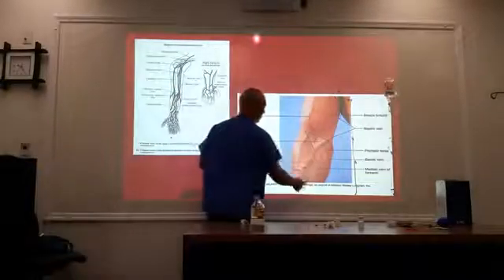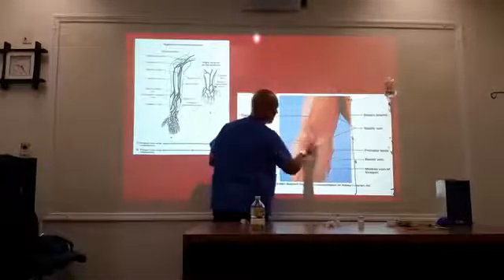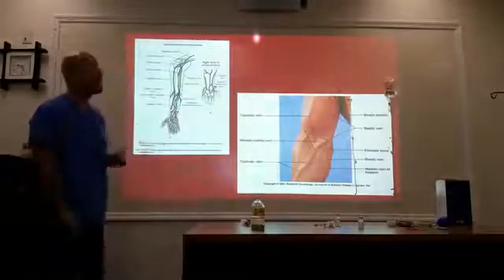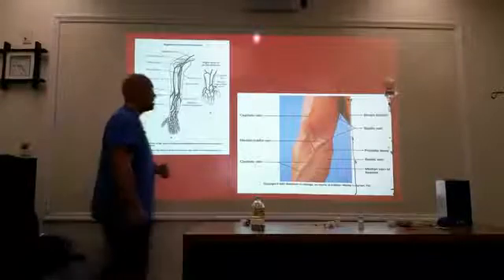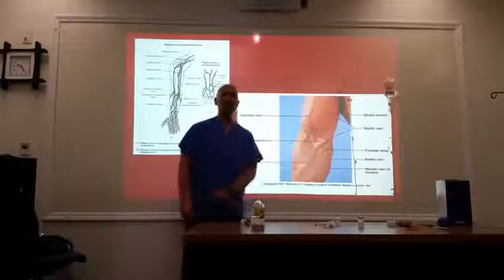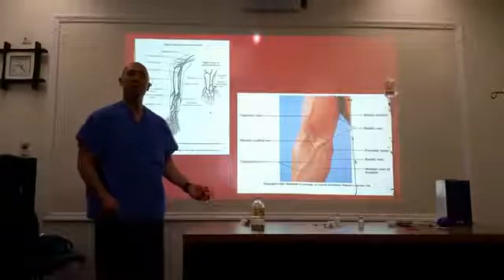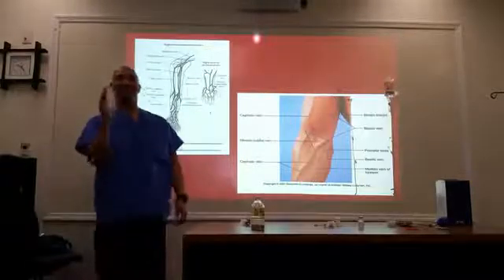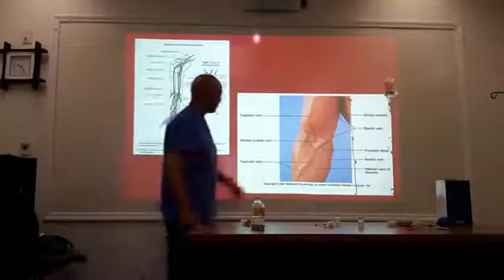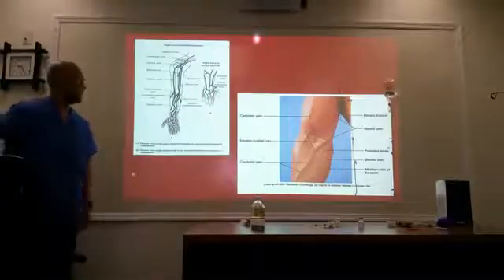This is the good vein right here. It runs across the forearm and into the basilic vein over here. This is the cubital, median cubital, or the antecubital area. Okay, this is the one that we like to stick the most. Okay, but don't get excited about seeing veins like that. It's very rare. Not only is it rare, but when you try to stick it, what do they want to do? They want to do this. They want to move around and wiggle. Okay, so sometimes they're good, but they can also be a challenge. All right.